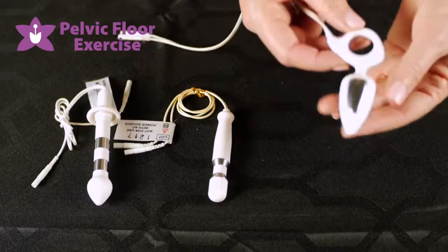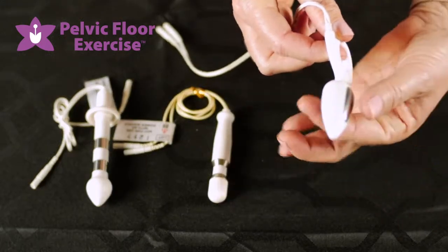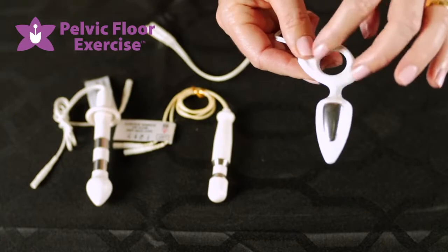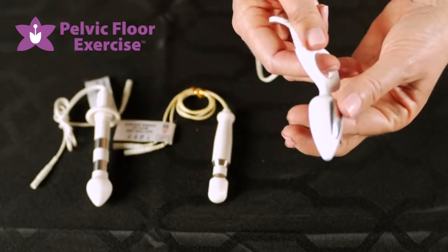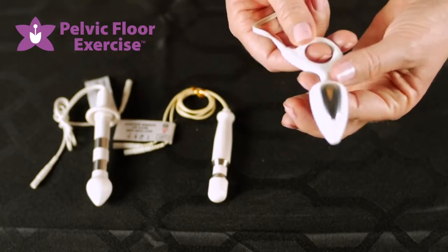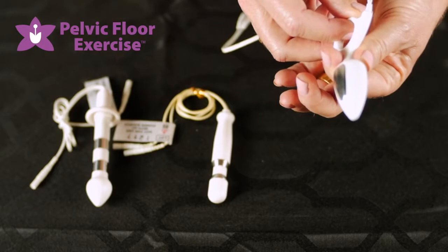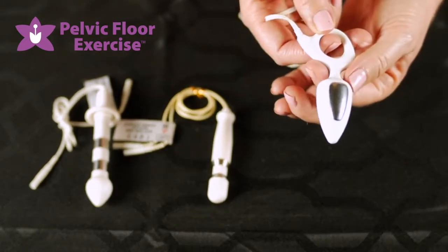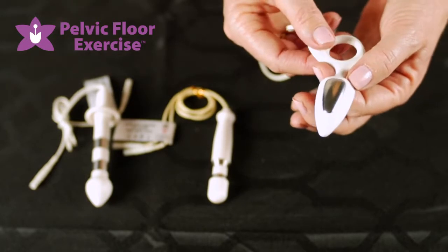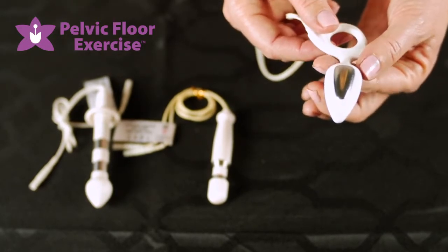Now we're going to have a look at the anal electrode range, starting with the aniform. It's the smallest in the body but the widest, and it comes with a flange which makes it easy for insertion and removal. The aniform is very comfortable to use and the applications include someone who has a quite weak external anal sphincter.